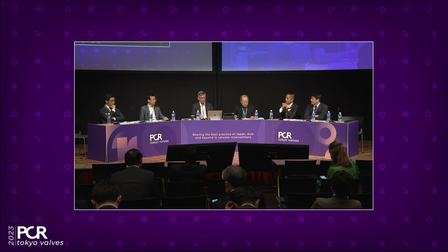Yeah, there are at least two things which need to be fulfilled for all valves if you want to have commissural alignment. First of all, it needs to be possible to see where the posts are. I think all the companies are now working to make very clear landmarks so you can see where on the stent frame the posts are located when it's still loaded inside the capsule. The second thing is that it should be possible to torque the system, to try to rotate it. I know that all the companies are working on different solutions; some will probably have a knob at the end of the delivery system, so you can just turn it around and it spins.